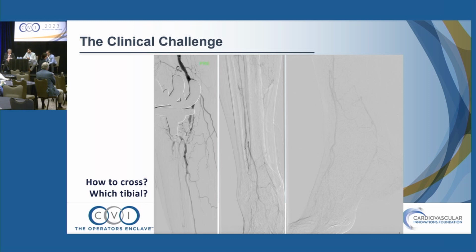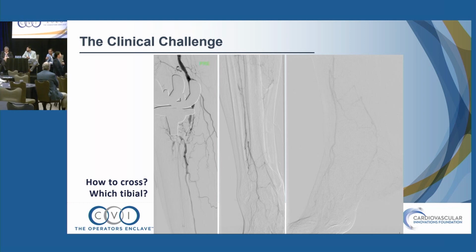Yeah, so I think I usually just go for the low-hanging fruit. Although the angiosome concept is helpful, the peroneal is really the lifeline of the leg and the foot. The peroneal is going to give off your communicating arteries to the posterior tibial as well as the dorsalis pedis artery. So here I would probably go retrograde peroneal access.